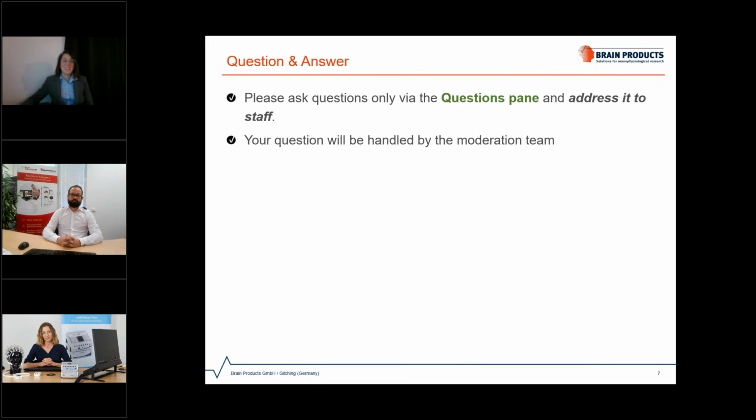Great. Thanks so much for that answer. I think we have probably one more question, and this one is, can the eye tracking data be used in combination with the EEG to inform the ICA analysis for blink removal? I guess that's for me. Yeah, so that can be done basically.